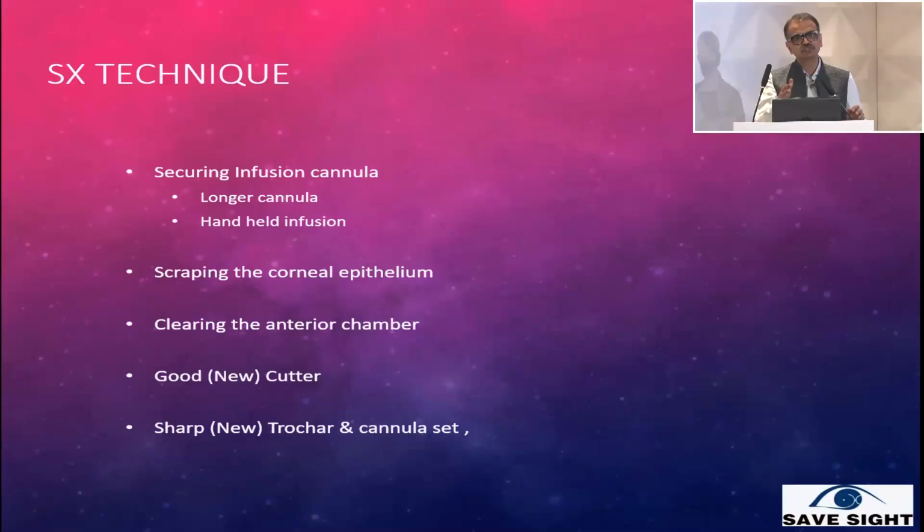So what I do is I charge more for my endophthalmitis cases from my colleagues who refer these patients to me. And I use these instruments only twice. Once I've used them, we ETO sterilize them, and I use them once more, then I discard them.